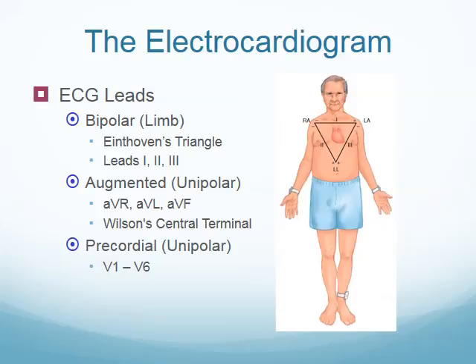Welcome to PowerPoint number 2, where we're going to really delve into our EKG interpretation. We'll start talking about our lead system, what we have on our EKG monitor. I'm not really sure how familiar anybody is with this information, so we're really just going to start from the beginning and cover most of it in fairly good detail.